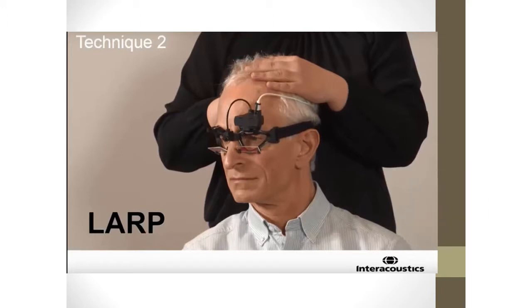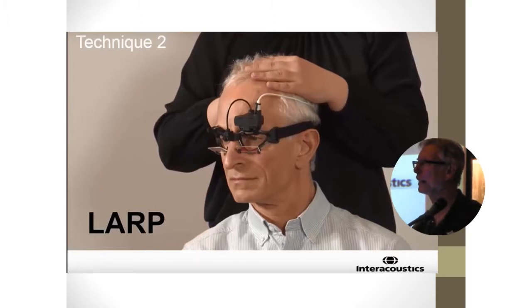And again, this takes practice, especially the vertical movements. The horizontal movements are the ones that we teach first and get people to actually be able to do that consistently. And I tell people whenever they are doing something that's technique sensitive, get to the point where you can walk into your clinic and you can say, I can do this test on any of you normal people and come up with normal results immediately.